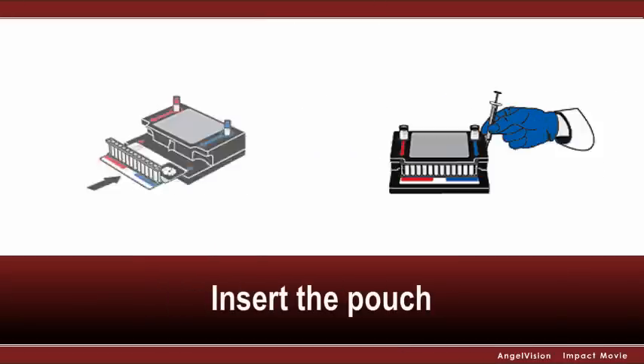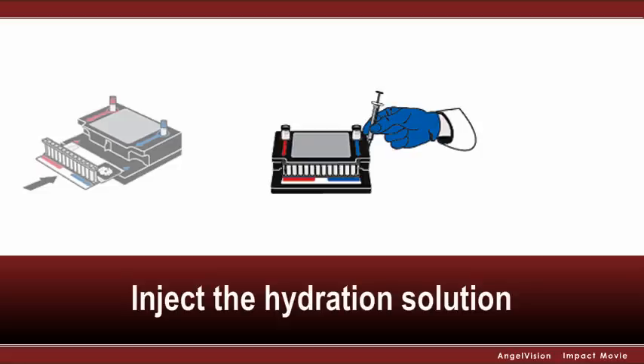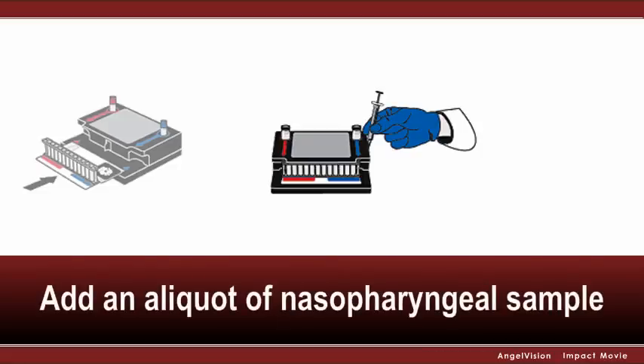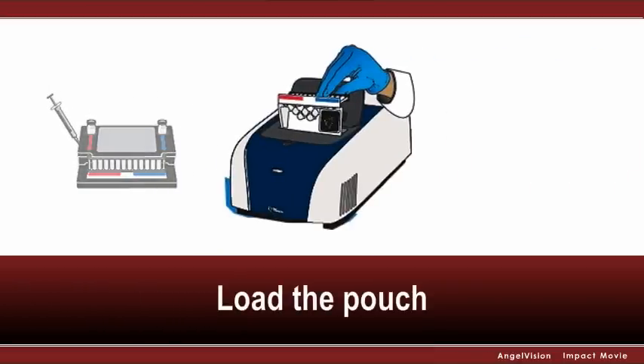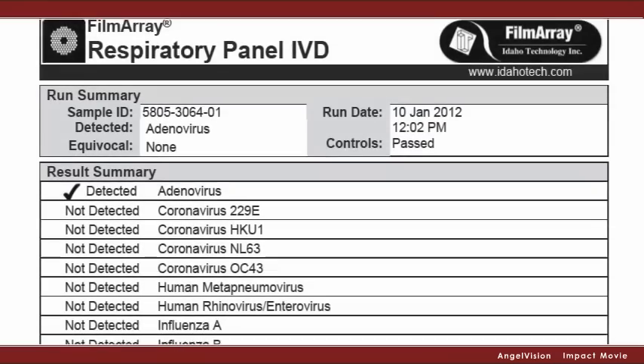Here's how it works. Insert the pouch into the loading station. Inject the hydration solution. Add an aliquot of nasopharyngeal swab sample to a buffer. Inject the sample. Then load the pouch into the Film Array instrument and start the run. About an hour later, you've got your results.